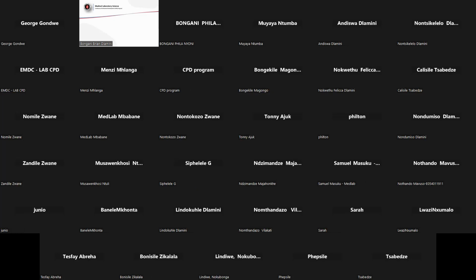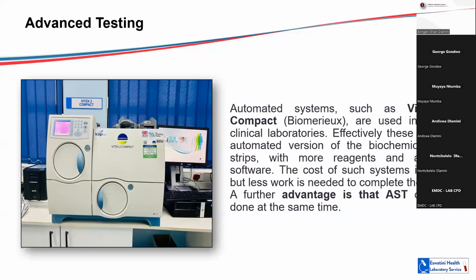So as I was saying, for the VITEK MS, you are able to get your results within minutes, but for the VITEK 2 Compact, your results may come out ranging from 4 hours to 20 hours or more. Organisms which take longer may require more time. Organisms such as E. coli, which are fast growers, may be identified within 4 to 10 hours, but some Gram positives mostly will take longer, like 18 to 24 hours for them to be identified.